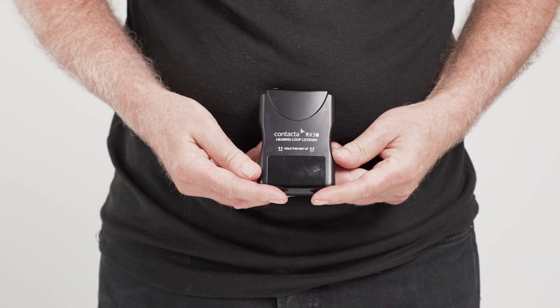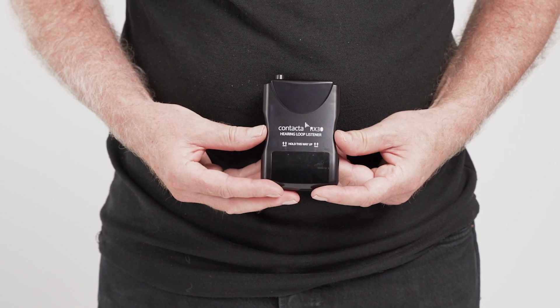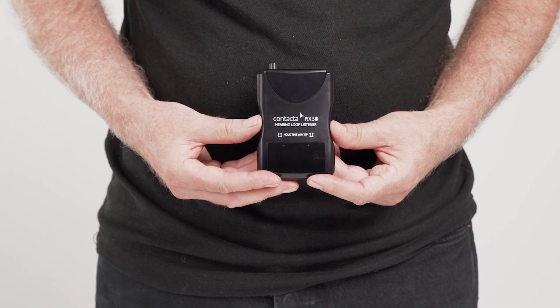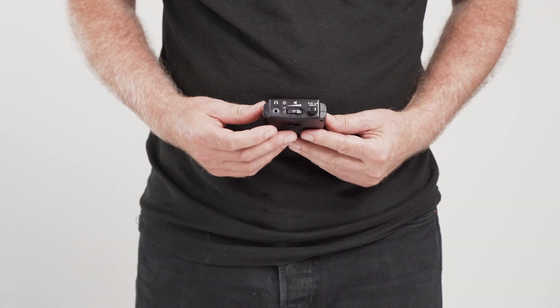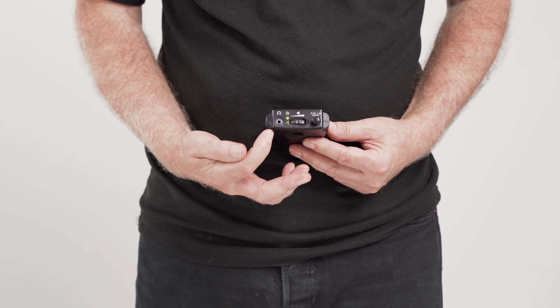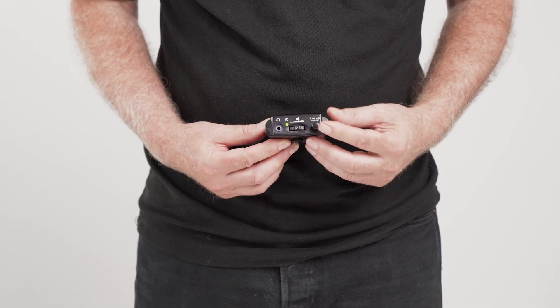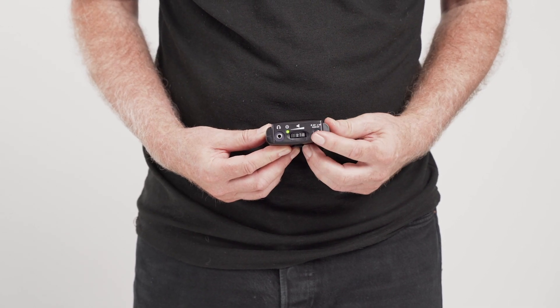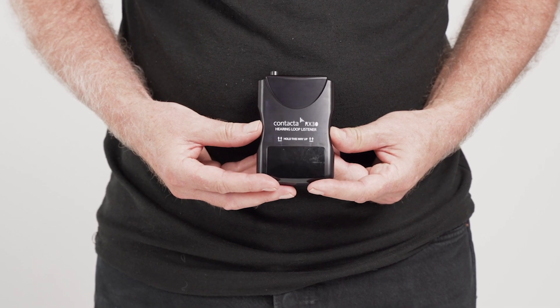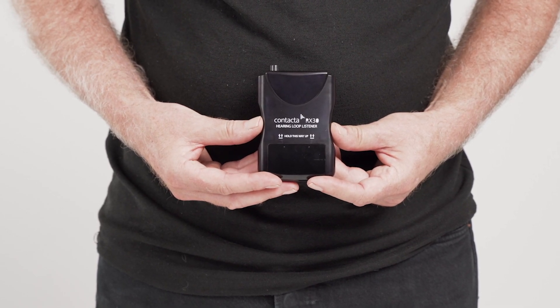When using the RX30, ensure it is held up this way as labelled on the device. Holding the device vertically ensures that the inbuilt telecoil is in the correct orientation. To switch the unit on, use this rotating button, which is also used as your volume control. The green light here indicates that the device is switched on. This is the bass cut switch — it can be used to optimize the sound by pressing, and is useful for removing the low frequency humming sound found in venues.